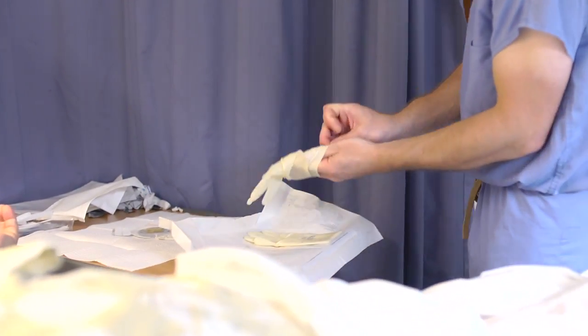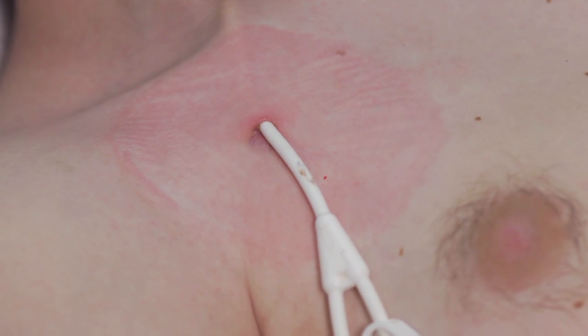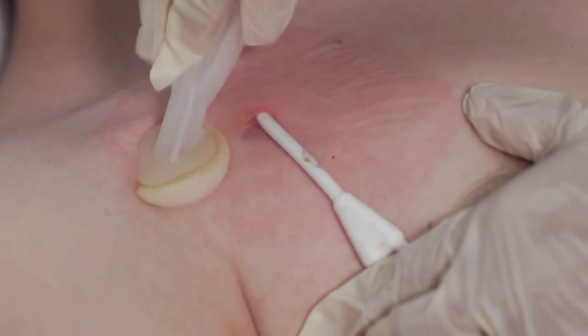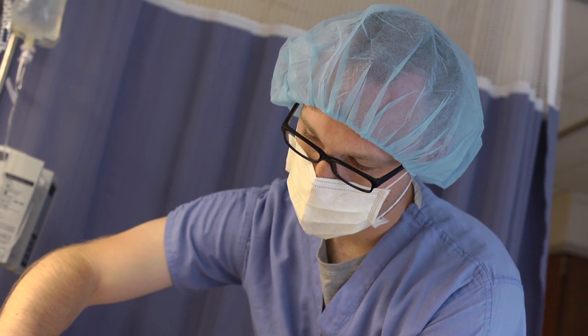After the sterile gloves are on, only the sterile equipment can be touched. The first step is to clean the skin that was under the dressing with the skin disinfectant. You scrub the area around the line, up and down and back and forth for 30 seconds, and after, once along the length of the line. Allow the skin disinfectant to air dry. No one should fan or blow on the site to speed the drying.